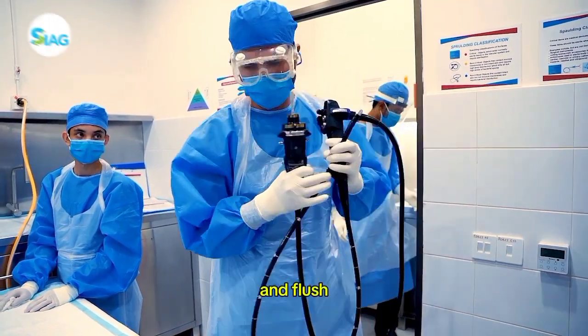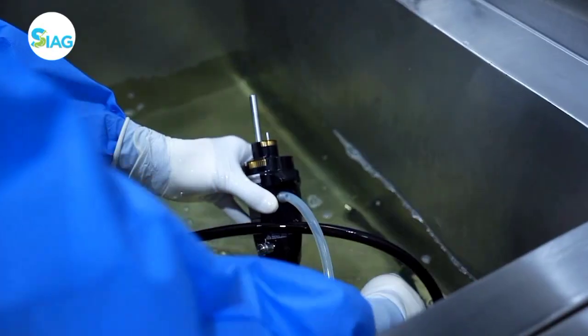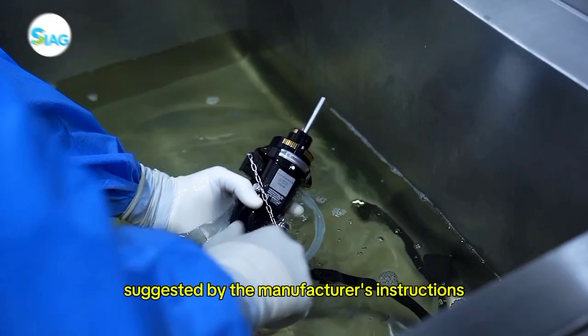Because residual materials can lessen the efficiency of the sterilizing procedure, make sure to brush and flush any residue that might be remaining in the channels and ports. Allow the scope and its parts to soak in the detergent for the duration suggested by the manufacturer's instructions.